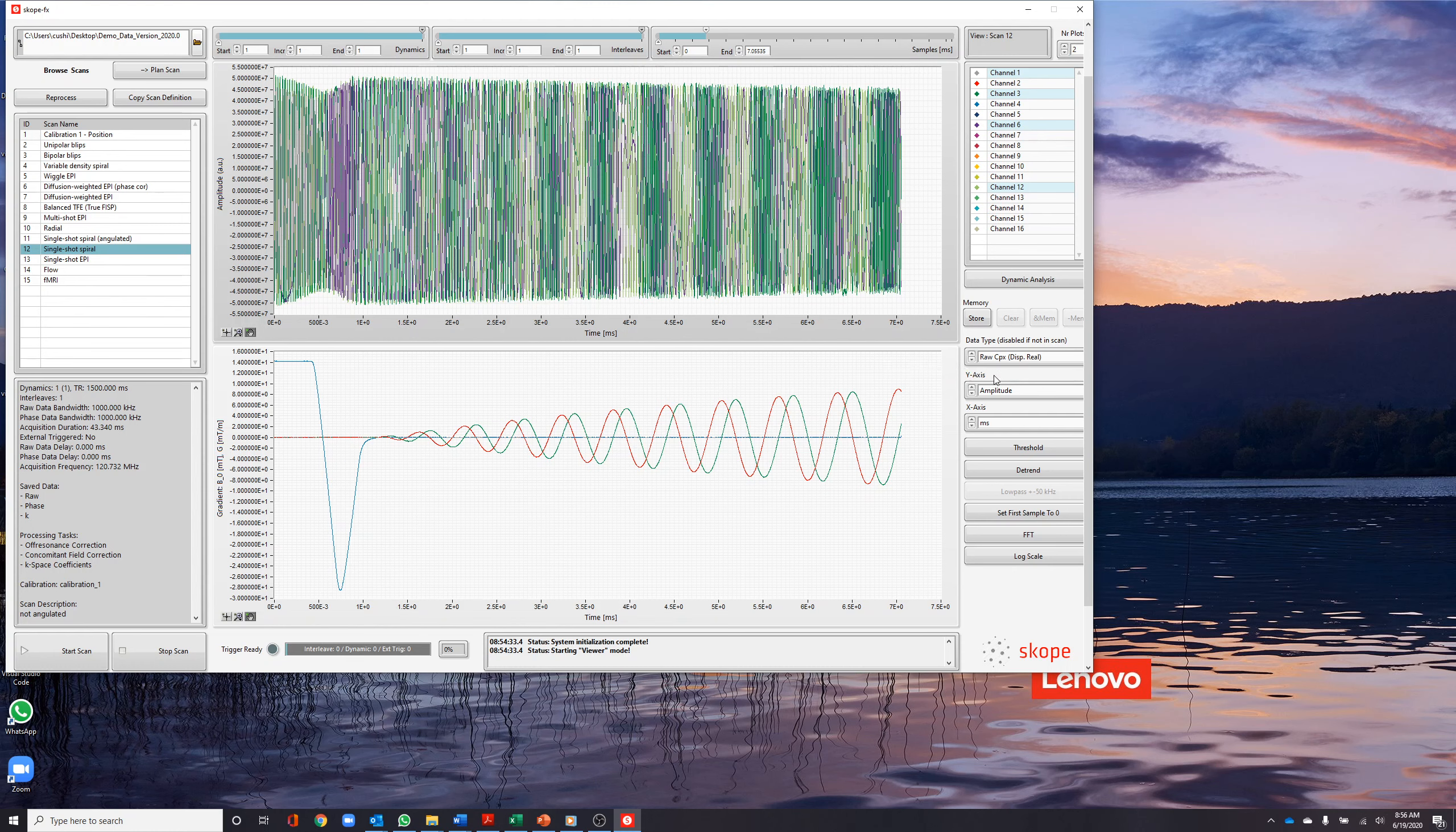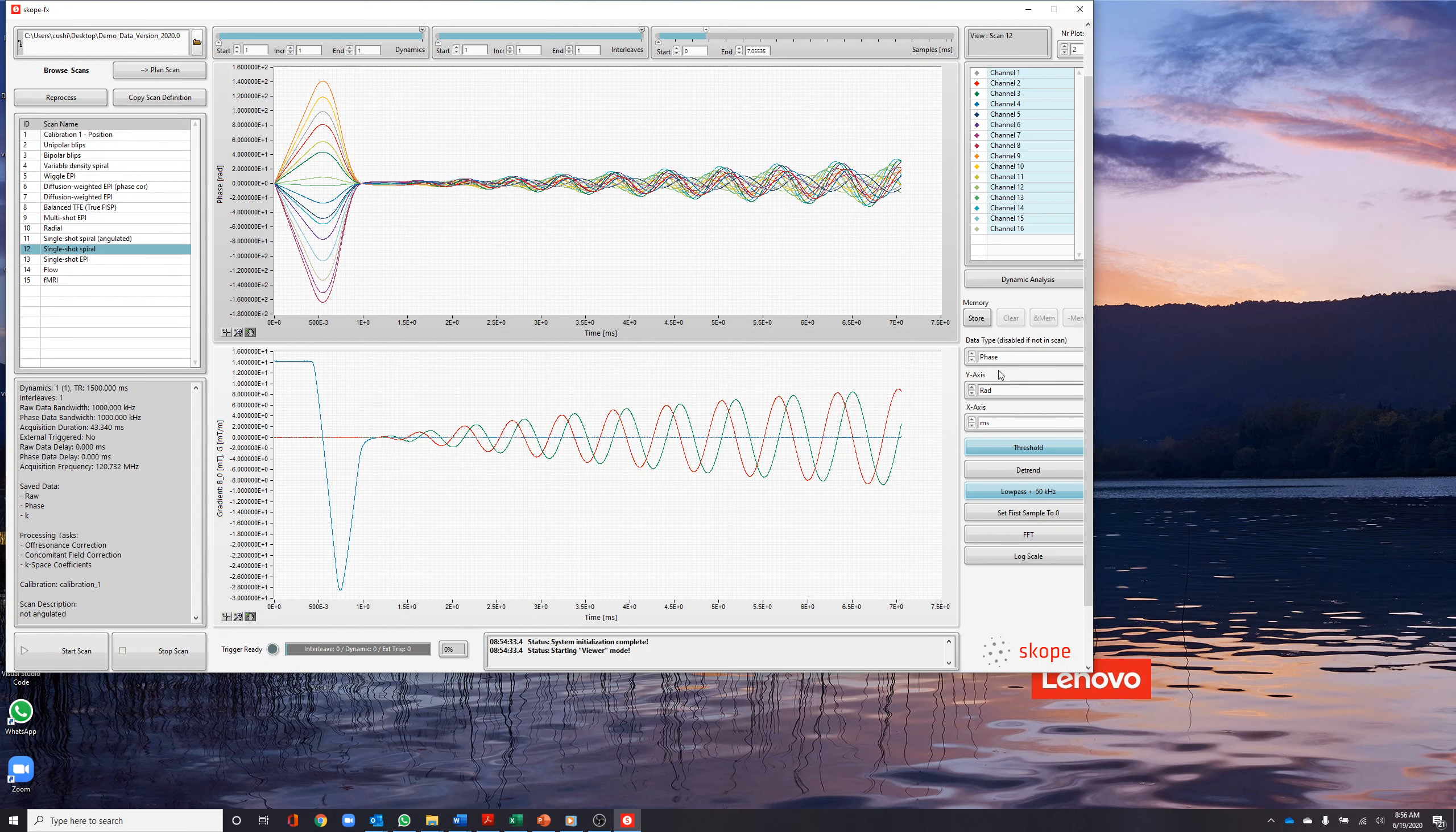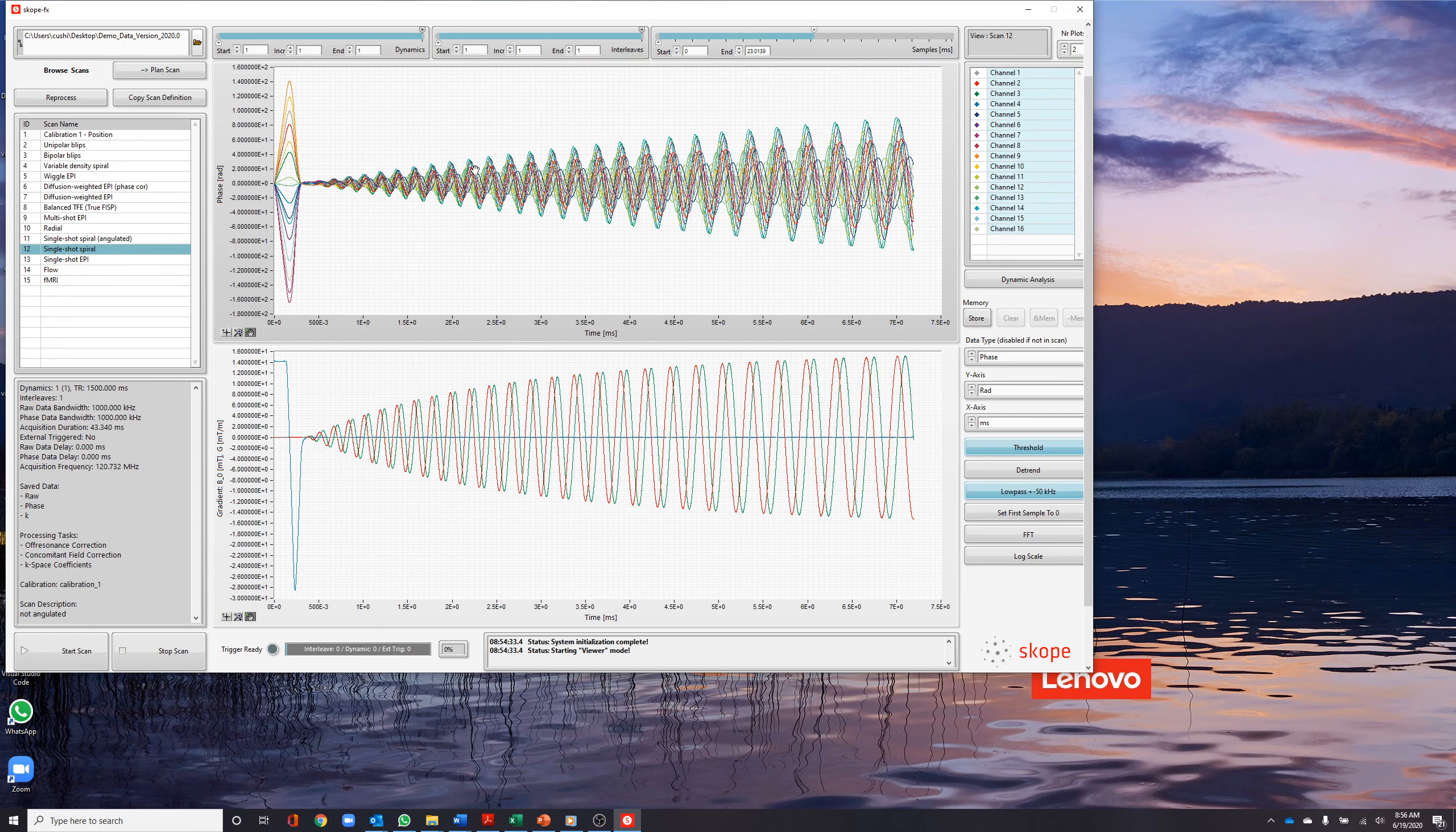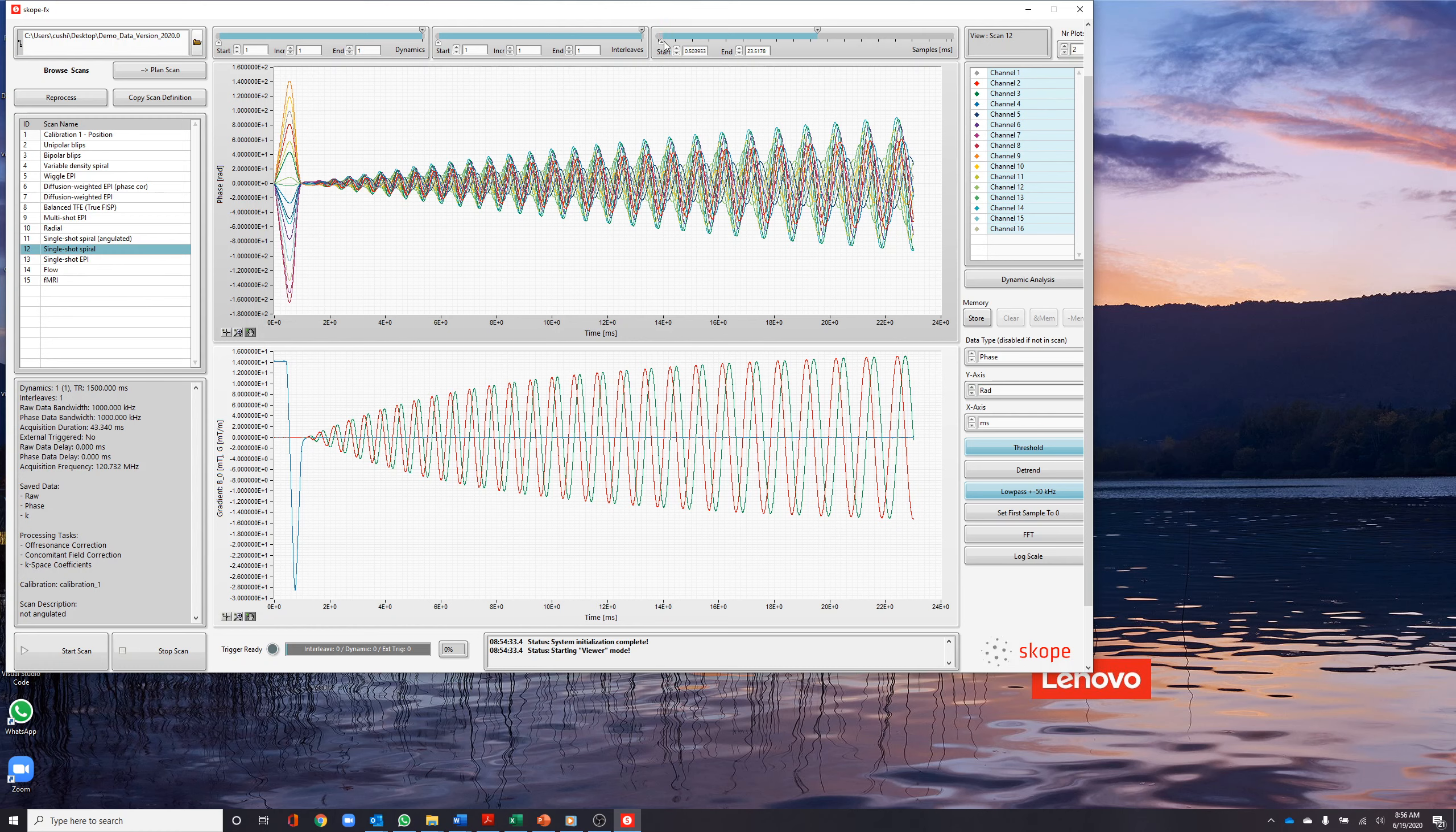We next select the phase data. This data has had the linear, time-dependent, phase accrual removed. The phase accrual caused by the slice select gradient is readily visualized. We can zoom into the readout portion of the acquisition by using the sample selection slider on the top right of the center column.